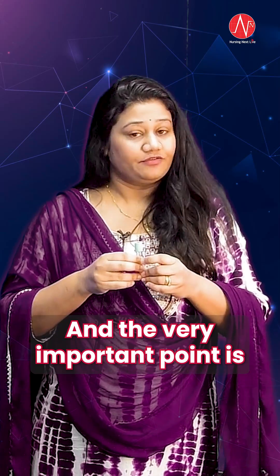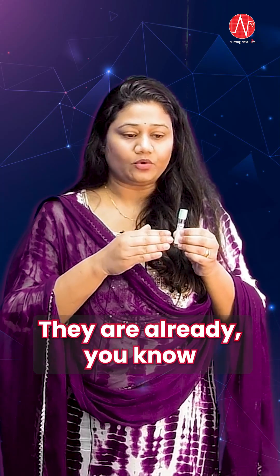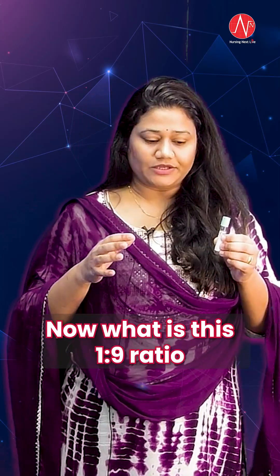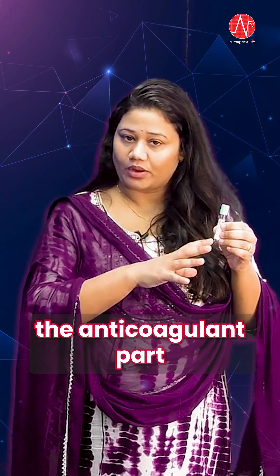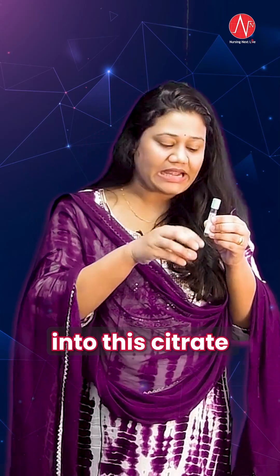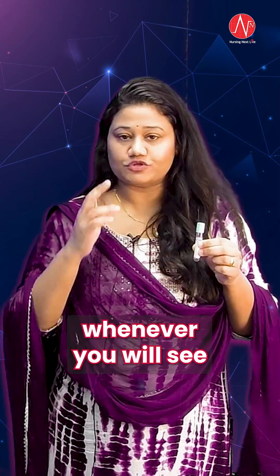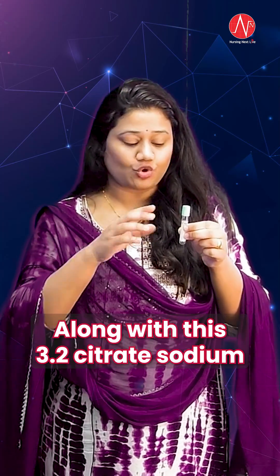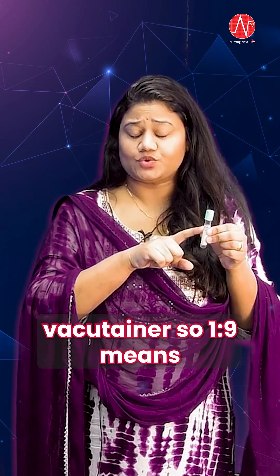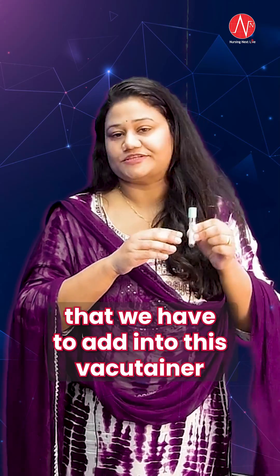The last and very important point is that this type of vacu-tainer, the citrate vacu-tainer, comes with a manufacturer guideline of a 1 to 9 ratio. What is this 1 to 9 ratio? 1 means the anticoagulant part, and 9 is the blood sample that we have to add into this citrate light blue top vacu-tainer. Do not get confused whenever you see a 1 to 9 ratio along with this 3.2 citrate sodium vacu-tainer.